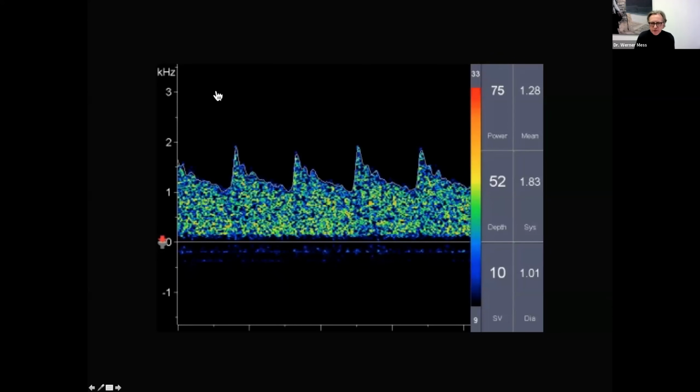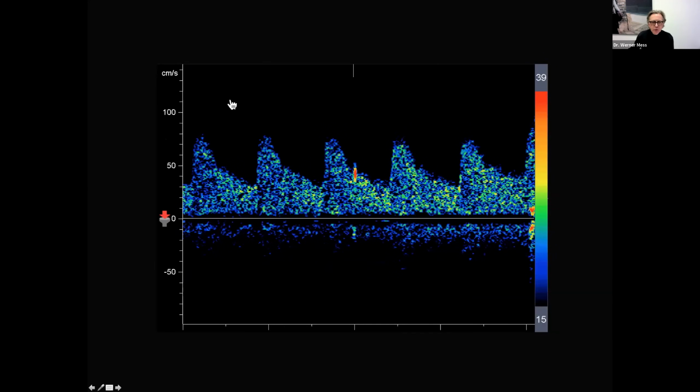Well, actually, I assume that this is pretty familiar to you, but now, of course, we get a next signal and it looks a little bit different and it sounds different. So listen very carefully. I do it once again because this is what it's all about. Okay, so I think you heard this blip or chirp in the middle of the signal, and that corresponds to this red dot over here. And this is a microembolic signal, or some people also call it a hit, high intensity transient signal.